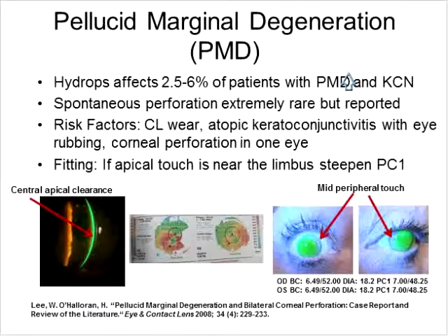Dr. Johns, could you comment on the manufacture of both front and back and/or bitoric scleral lenses? The bitoric can be tricky if the axis of your optical axis does not align with the scleral toricity axis, but oftentimes there's alignment with that.